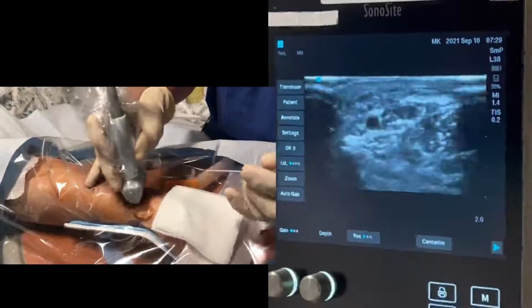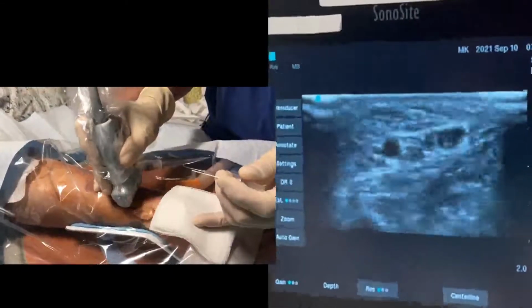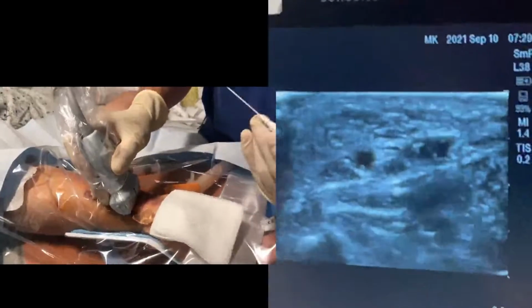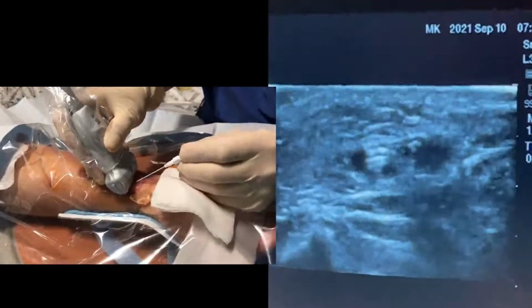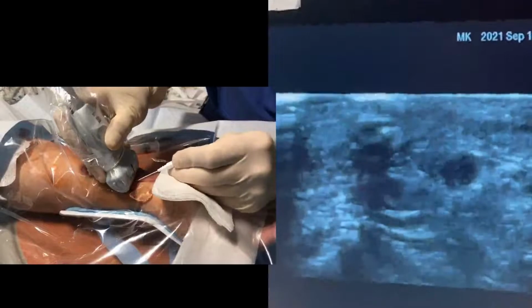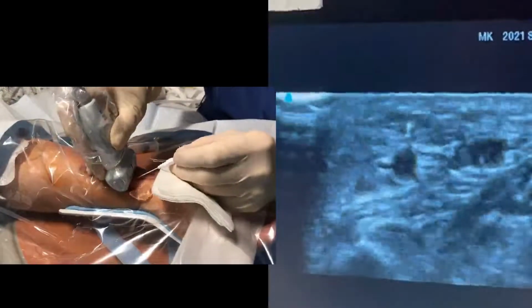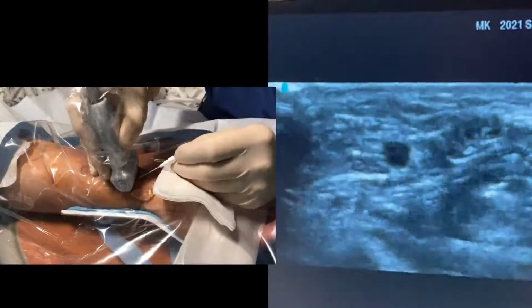And then we have the needle. We see the artery. We put it in the middle of the plane. We make the depth the least possible so we can see the artery as clearly as possible. You're going to see subtle movements of the hand holding the ultrasound probe, very, very slow. And the idea is to try to see the tip on the ultrasound screen. You see the little white dot disappear. When it disappears, it means we're actually looking at the tip. That's the tip right there.